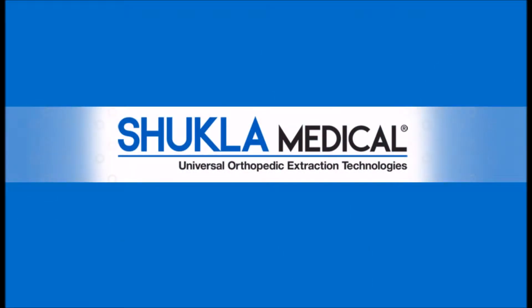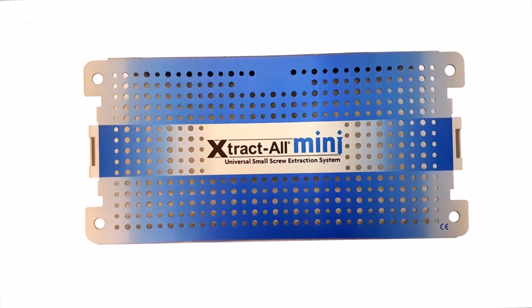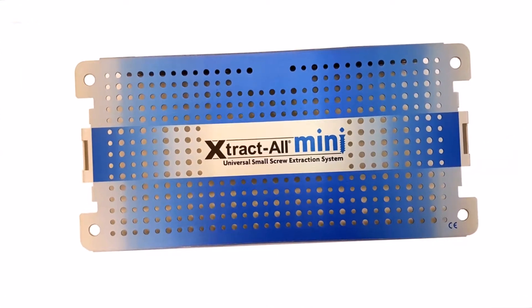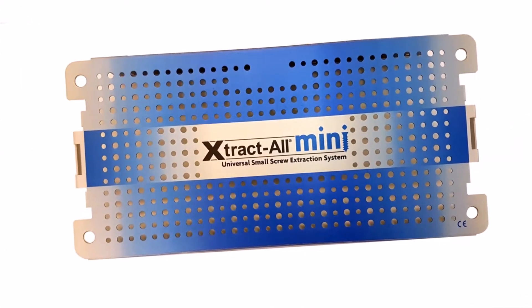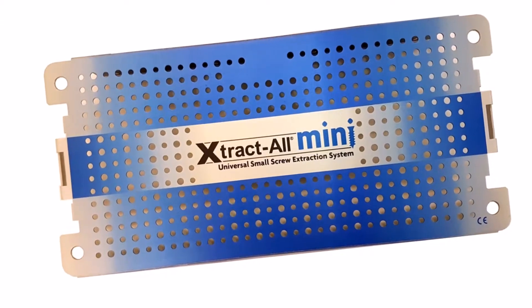Here at Shukla Medical, we are focused on continuous advancements in efficient hardware removal. Therefore, we are proud to announce the release of our next-gen Extractall Mini Screw System, designed to facilitate the removal of all small bone screws encountered in hand, foot, spine, and cranio-maxillofacial surgeries.